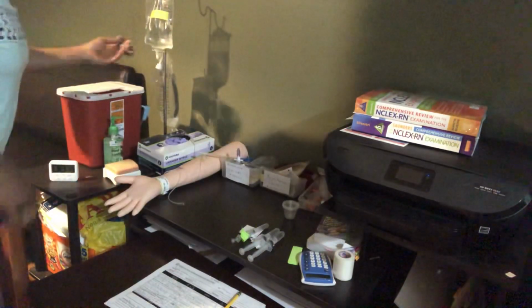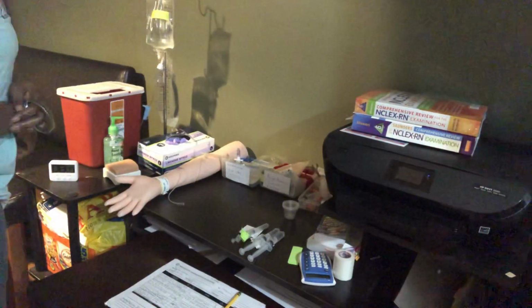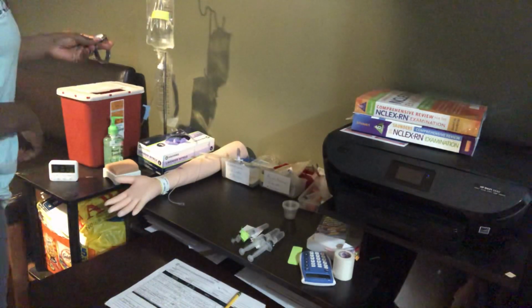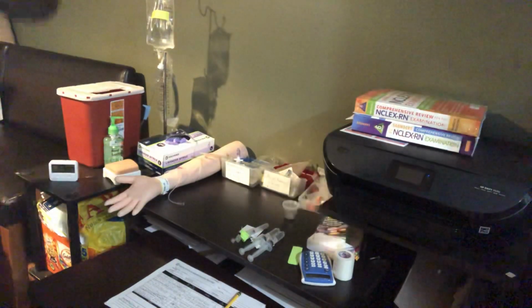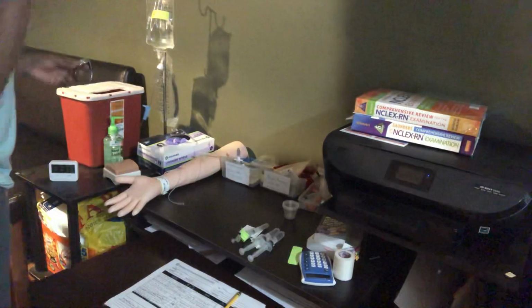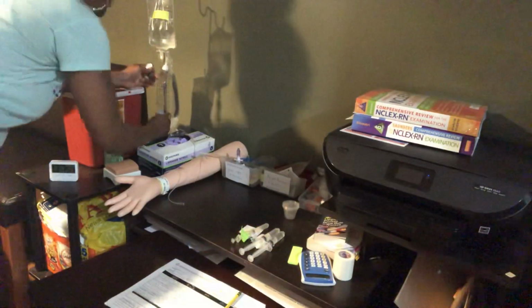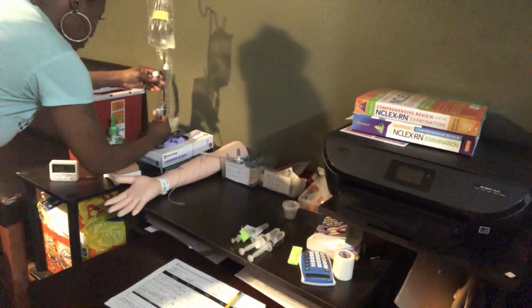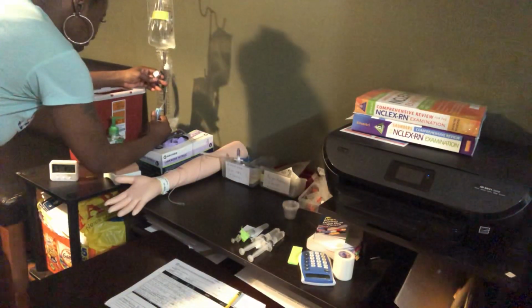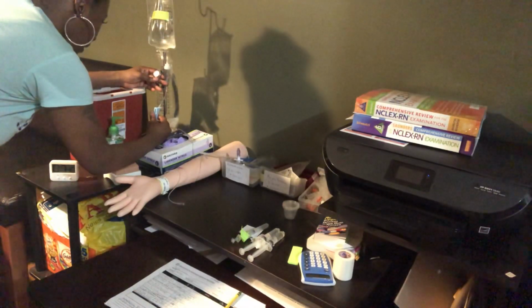I gotta find out how much you can be off, because that's 30. That's 38. Then that's 5 off. But I don't understand how that's happening. I'm gonna do it again because I got the time to do it again. But I'm trying to figure out, like, if I did the math, I don't understand if I can get certain drops in 15 minutes, why it's not adding up at 1 minute.